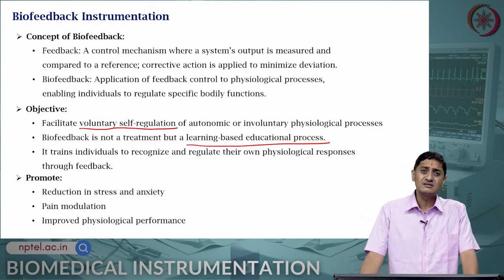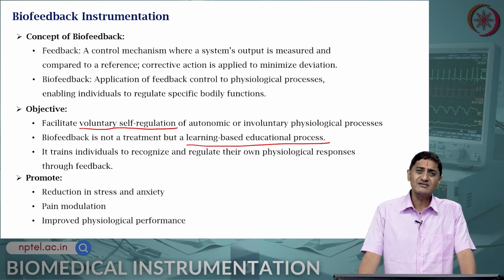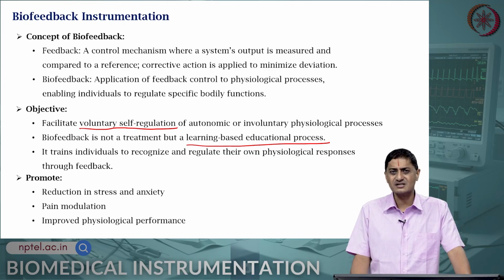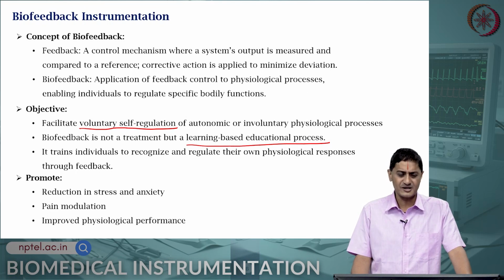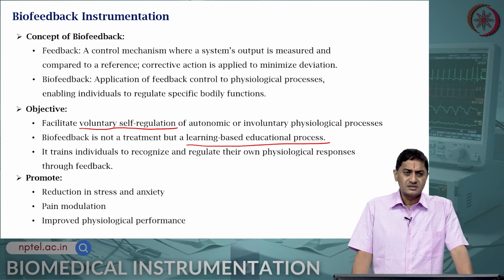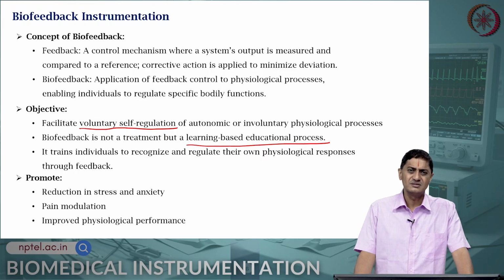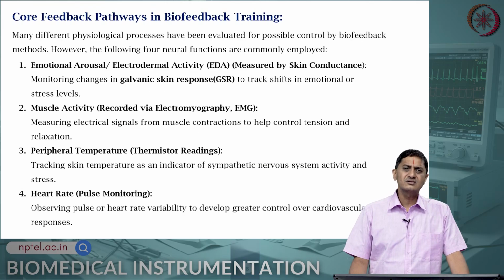So, people can take this input and train themselves to recognize and appropriately change or regulate or modulate their own physiological responses through feedback. It essentially promotes reduction in stress and anxiety, pain modulation, and improves the physiological performance. What are the core feedback pathways?